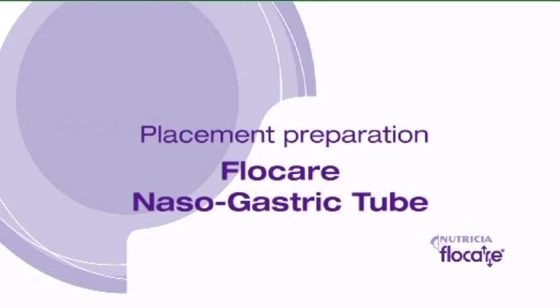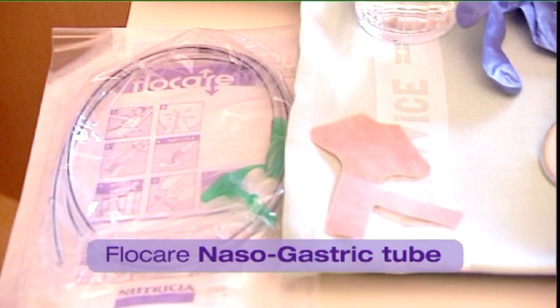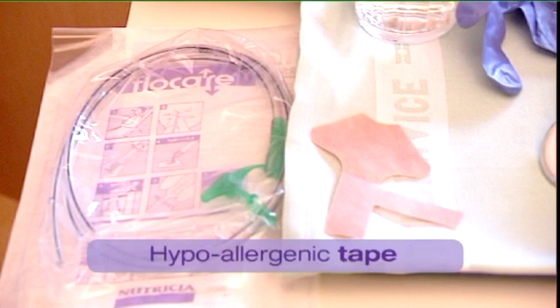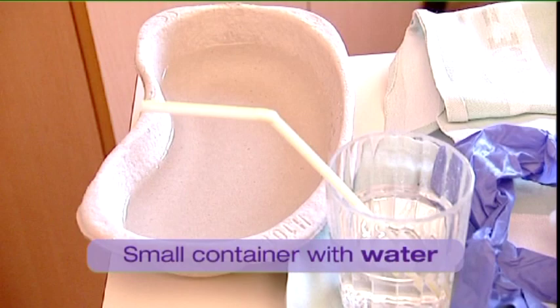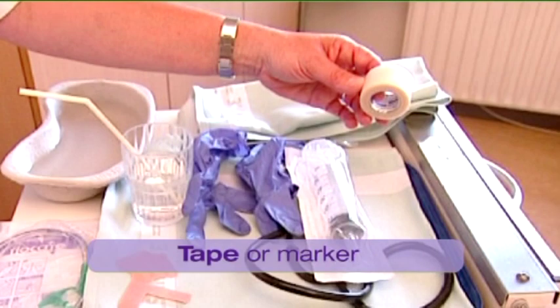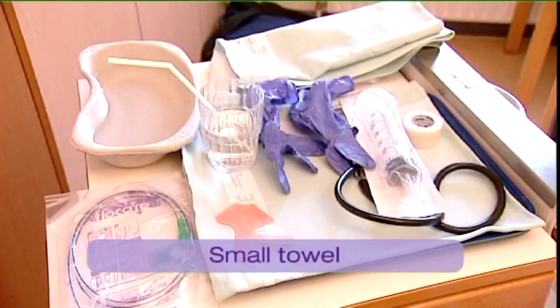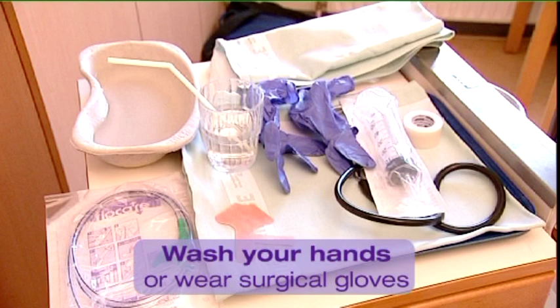Preparation. Prepare the following materials required for placement of the nasogastric tube: Flocare Nasogastric Tube, hypoallergenic tape, 50ml syringe, connecting tube, small container with water to moisten the tube, glass of water, tape or a marker to mark the correct placement of the tube, and a small towel.